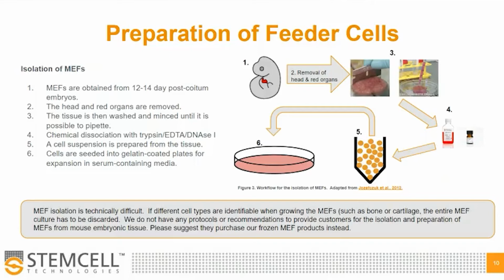We do not have any protocols or recommendations to provide customers for the isolation and preparation of MEFs from mouse embryonic tissue. Please suggest they purchase our frozen MEF products instead.